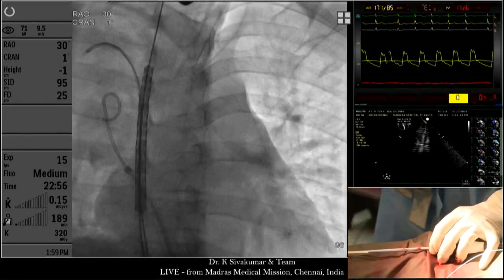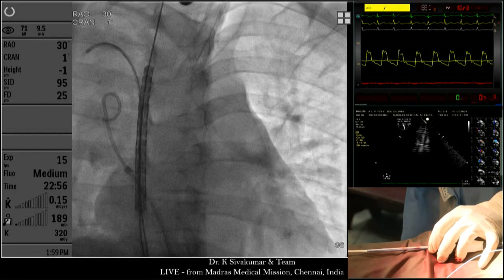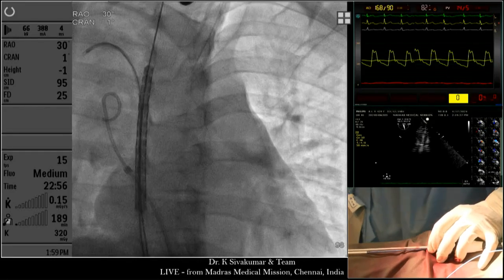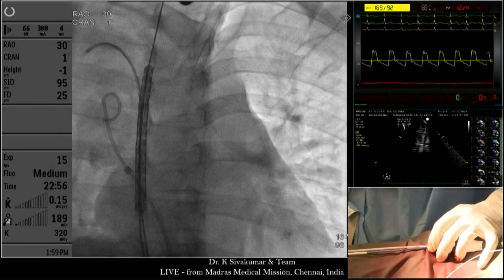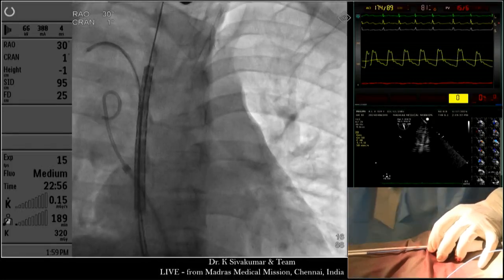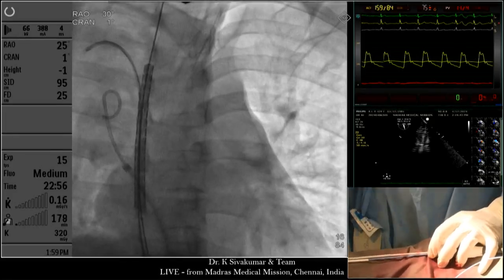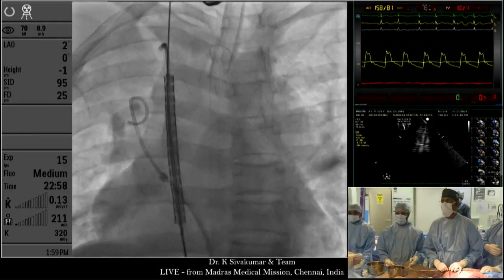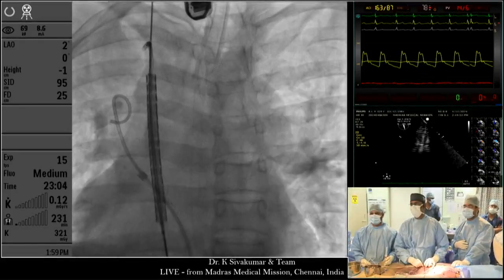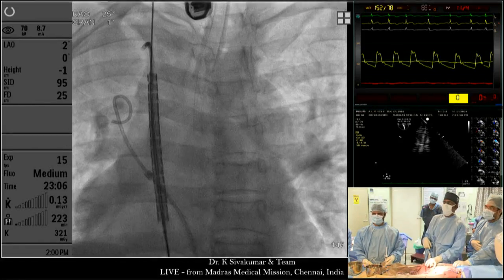Okay. So now it's precisely like a double balloon, a single stent, double wire strategy. My uncovered portion is in the superior vena cava above the pulmonary vein. So what we'll do now is come back to the AP. Sivakumar, in this view I think you're going to need to come way more proximal, because you will not be able to close the ASD with this. Now go to transesophageal and show the caudal end of the stent.